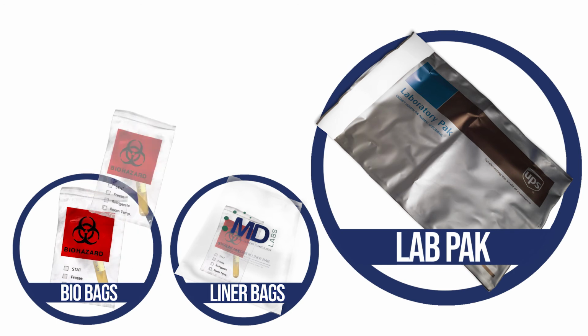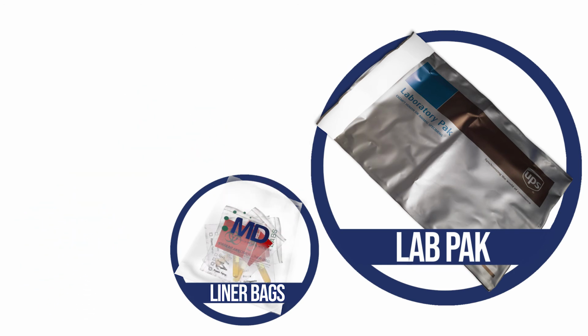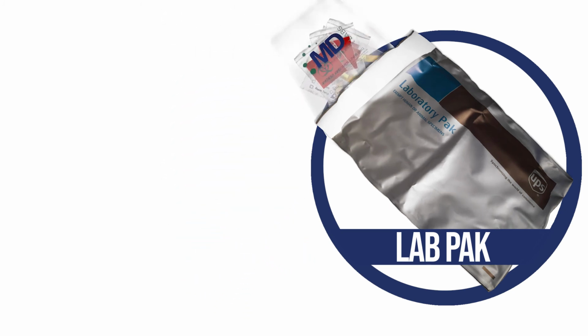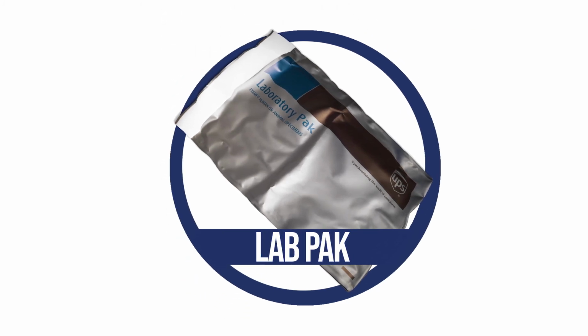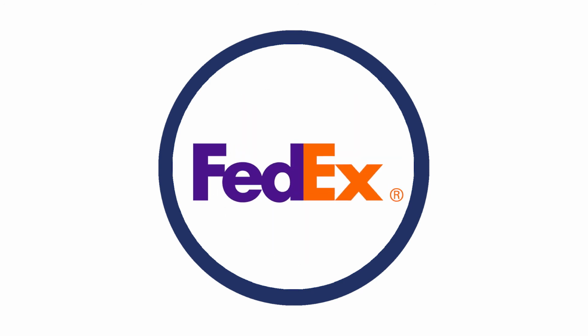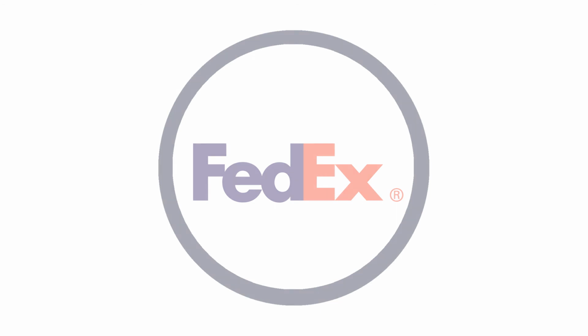Place as many specimens as will fit into the MD Labs liner bag, and place as many MD Labs liner bags as will fit in the UPS or FedEx lab pack before shipping. Sending a single specimen at a time, while sometimes unavoidable, creates excessive shipping costs. Lab packs can be dropped at any UPS or FedEx location or drop box, or scheduled pickups can be arranged by calling UPS or FedEx. You can contact the lab to arrange regular pickups.